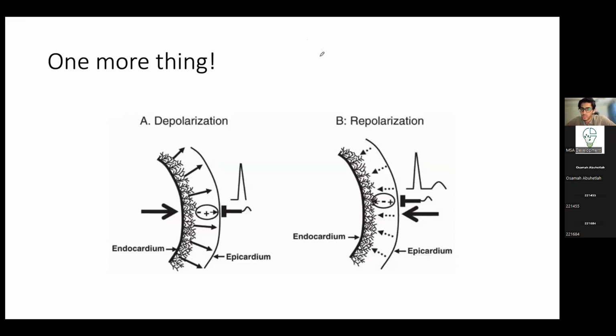Is this clinical too, or are we just going to describe it with lead 2 in this lecture? Do doctors generally look at lead 2? When you have a 12-lead ECG, at the very bottom you will find something called the rhythm strip, and most of the time the rhythm strip is actually lead 2. So for me, when I read an ECG, of course you have to be very holistic, but to determine, say, the rate and regularity, I always look at lead 2. That doesn't mean you forget about the other leads, because we can have something catastrophic happening in, let's say, V5 and V6, and lead 2 looks completely fine. So look at all the leads basically, but for the purpose of simplicity, we're going to focus on lead 2 here.